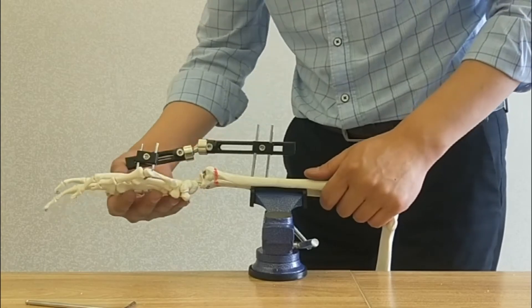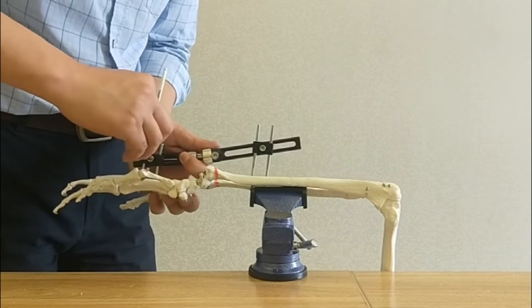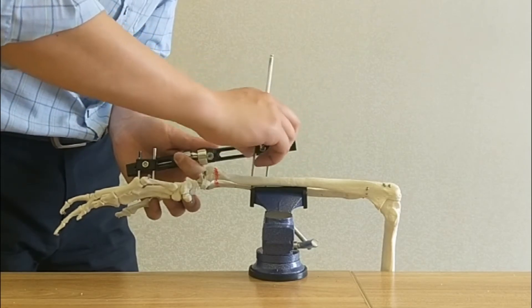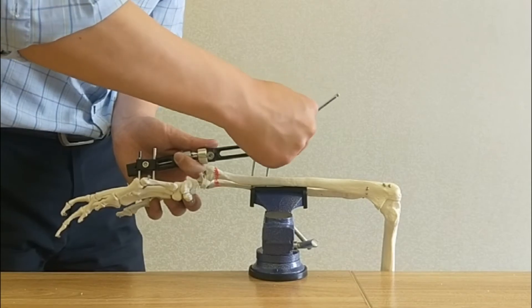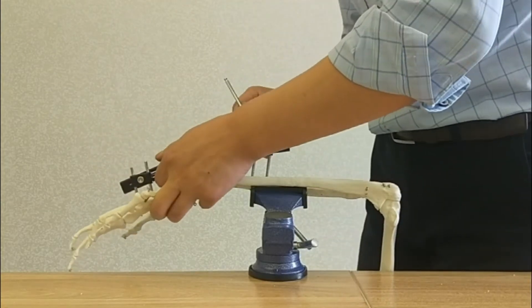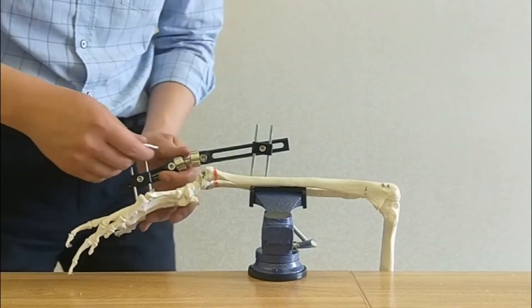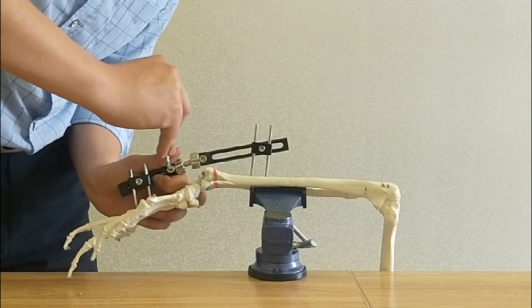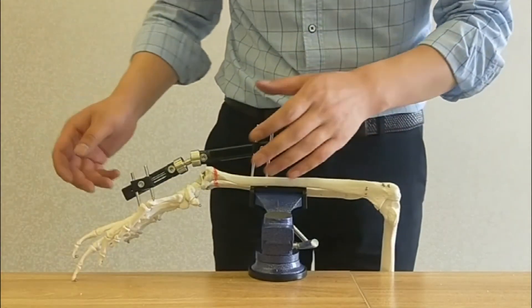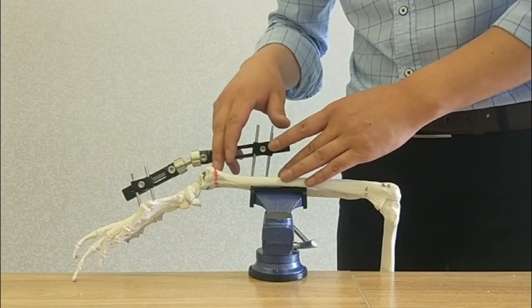Now we will have the reduction of the fracture under the X-ray machine. After the reduction, let's tighten the external fixation and tighten the back part. This demonstration is for a fracture line which is near to the wrist joint. If the fracture line is far from the wrist joint, we will use the forearm external fixation.